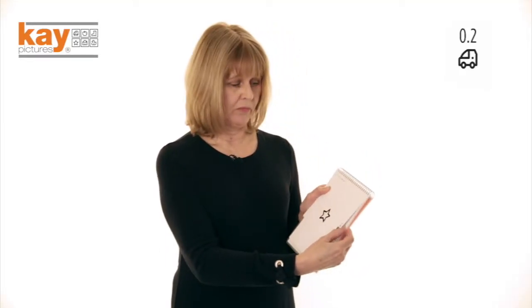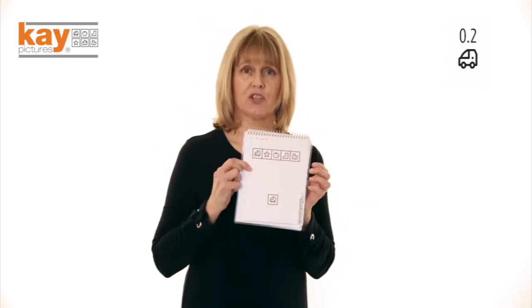These pictures are crowded and will give you an accurate visual acuity measurement that you can compare with your screening protocol. From 0.3 size, you can choose to show a row of pictures or a single picture, depending on the age and concentration levels of the child being tested. You just cover up the one you're not using so the child knows where to look. The picture on the tab relates to the single picture that you're showing the child.